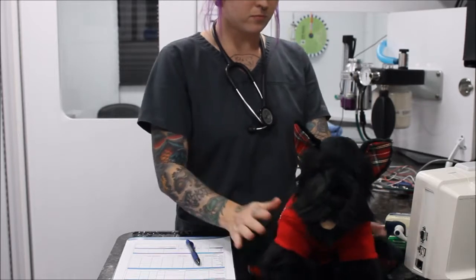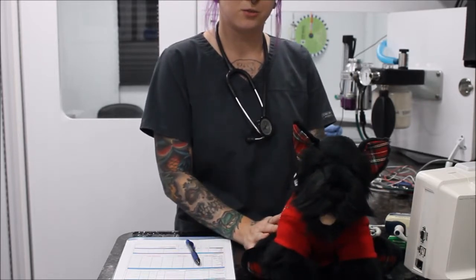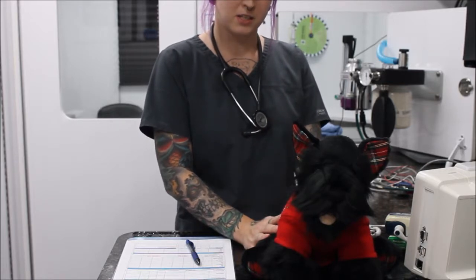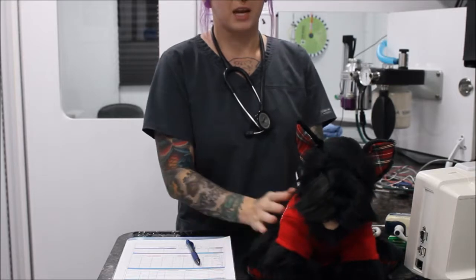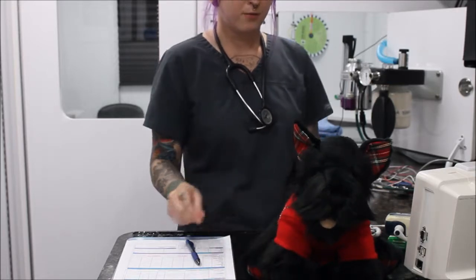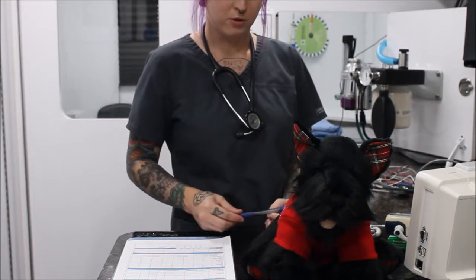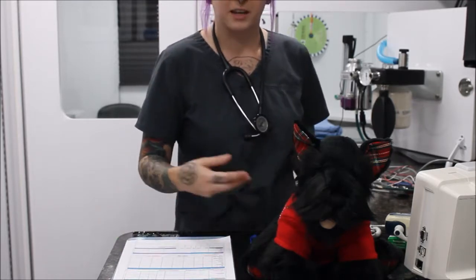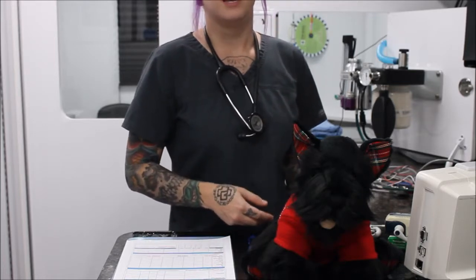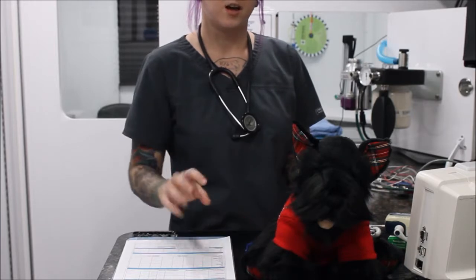So normal heart rate for a dog is 60 to 160 beats per minute. And for cats, we're looking around 120 to 180 beats per minute. So at some point, if the cat or the dog heart rate starts to increase, so tachycardia, that might indicate that we need to turn our anesthetic up.